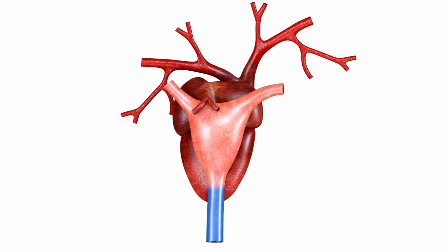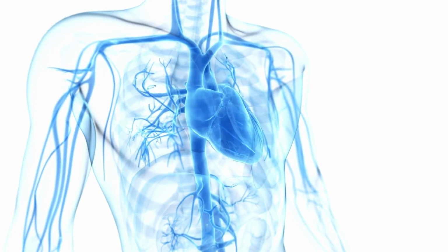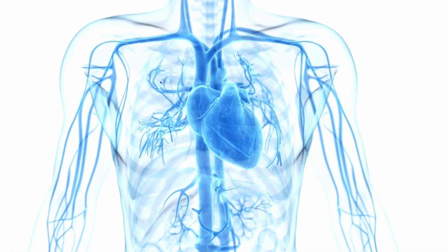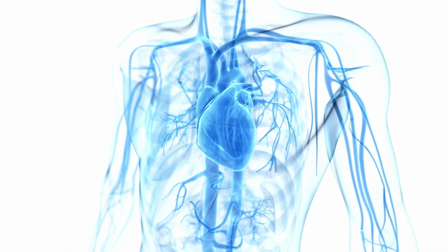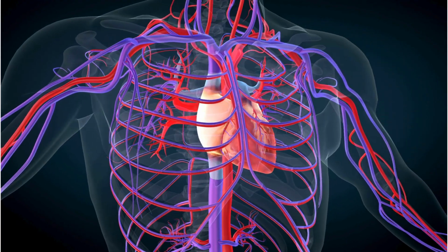Electrophysiology studies, EPS. Purpose: to diagnose and treat abnormal heart rhythms, arrhythmias. Procedure: catheters are threaded through blood vessels to the heart. Electrical signals within the heart are mapped to identify abnormal pathways.